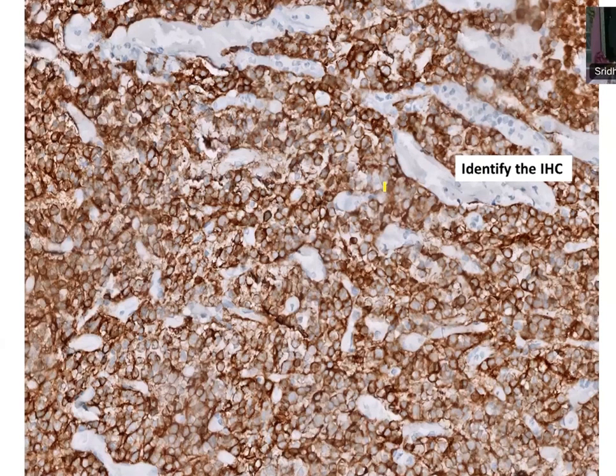Now, what's your diagnosis? Ependymoma. Very good. Supratentorial ependymoma, ZFTA fusion positive, CNS WHO grade 3. Okay. So there are other markers also done in this case, which I did not show you. BCOR is negative, but Olig2 is usually positive in BCOR positive cases. Okay. And LIN28 is also negative.